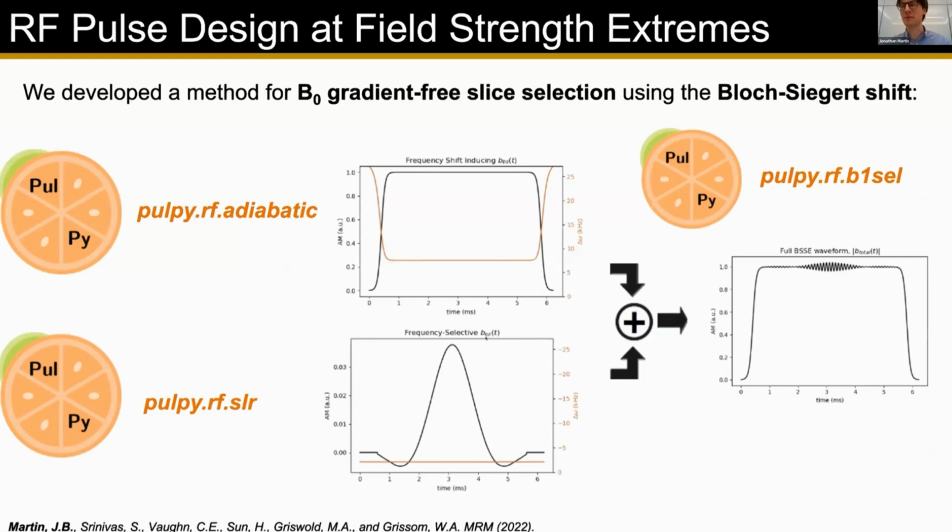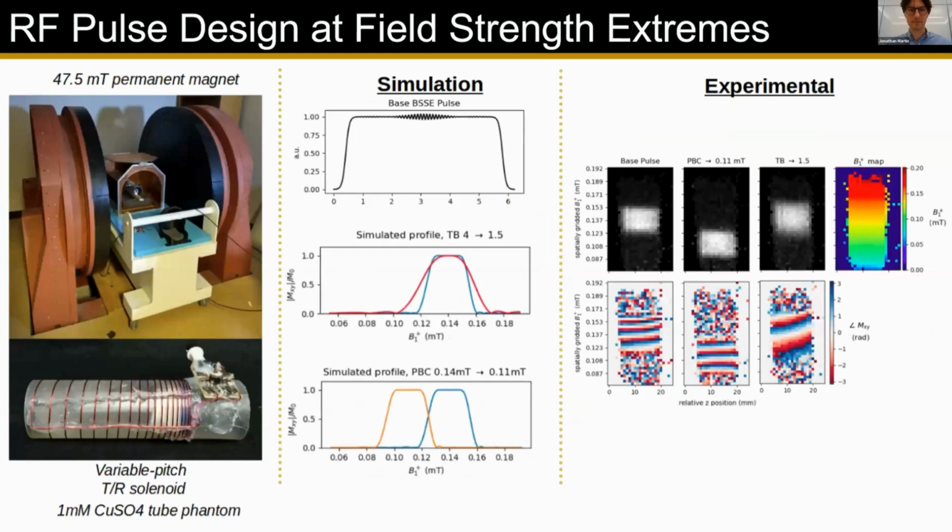So I think that having a nice tool that can maybe be compatible with a few different algorithms for whatever your MRI area is can make a big difference in terms of new research ideas. And this is something that gets investigated, I think, a lot at ultra low fields where you don't have these concerns about SAR heating and power constraints as much.